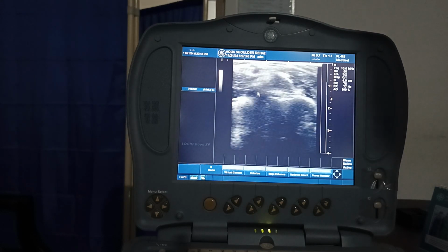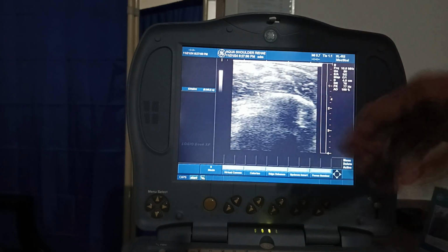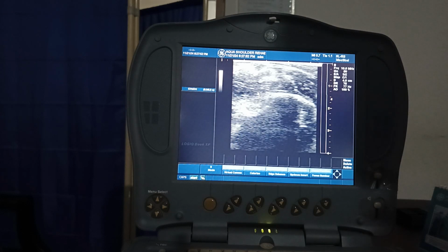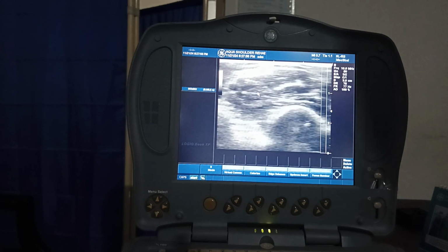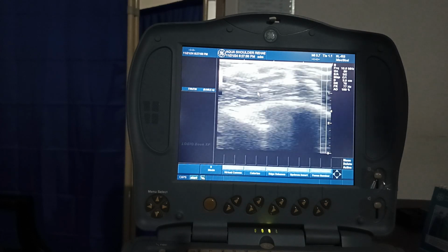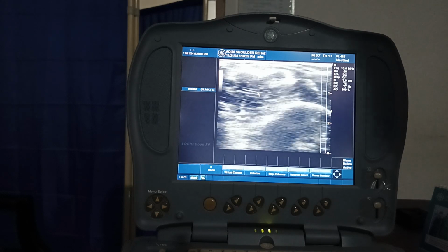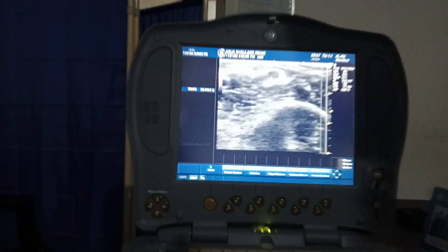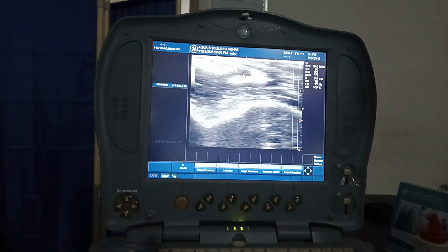One thing for sure, bear in mind that there's a lot of screen area being wasted. Why? Because we are too superficial now. This circular region is the tendon of the bicep, because she's too thin actually.